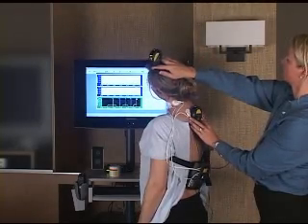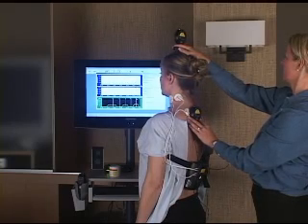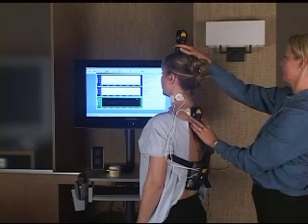And we're looking at the muscle tensions. We're looking at the valley of the muscle tension, not the range of motion. So we're looking at the top half of the screen, looking at the levels of muscle activity. Again, you hold the button down and it takes you to the right now.